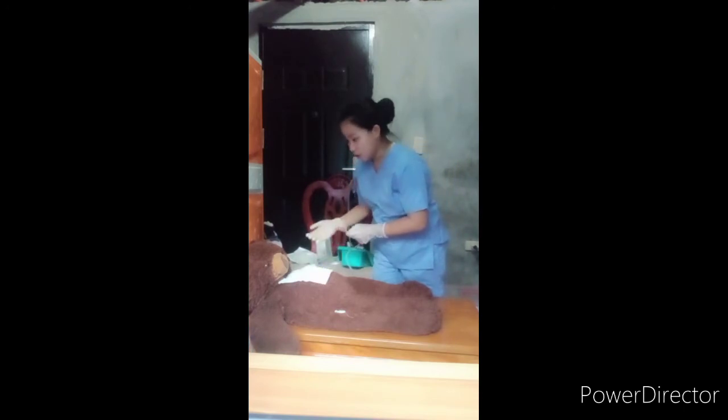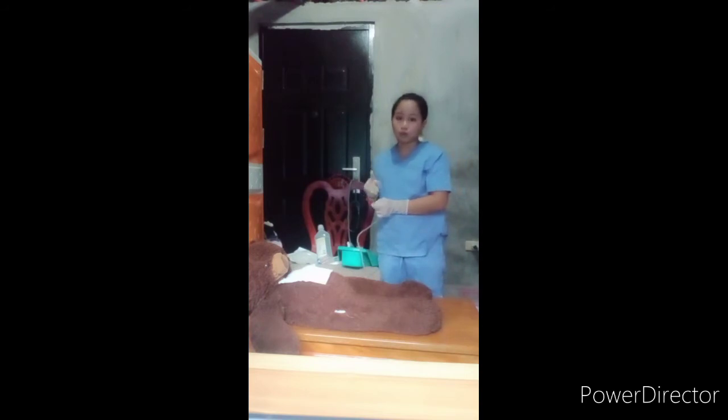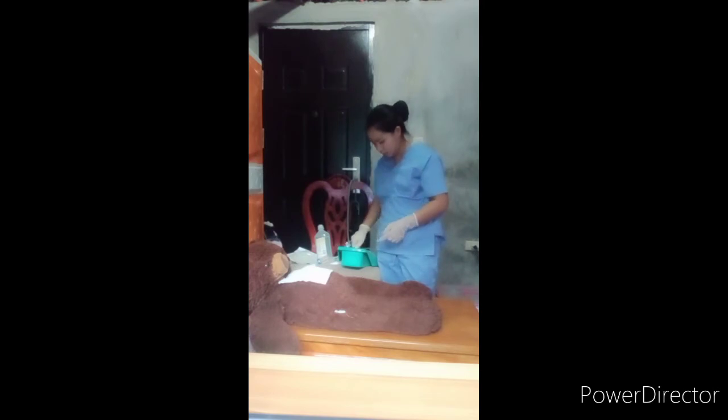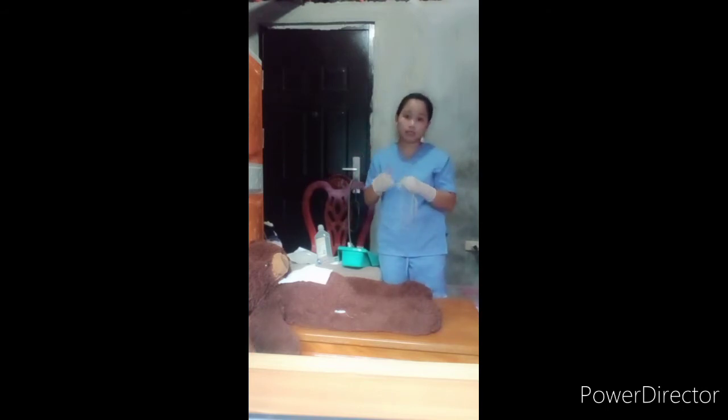Then next is, let's rinse the catheter and connecting tube with normal saline or water until cleared. Suction. And then next, after that, let's disconnect and turn off the suction and place it in a clean area.